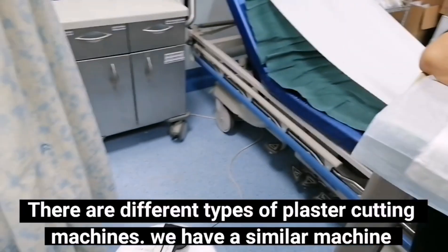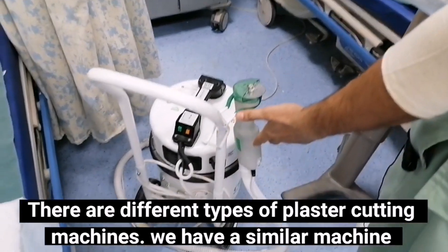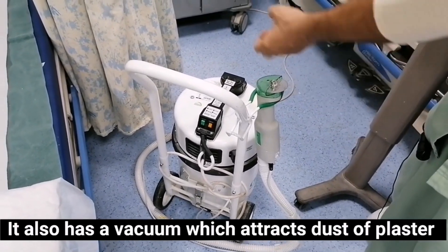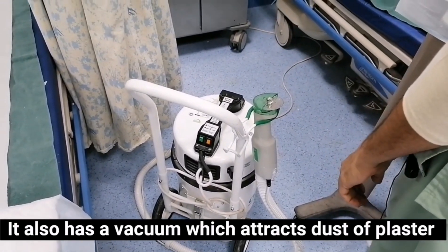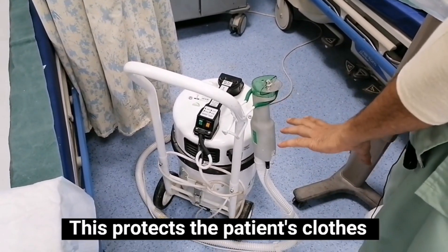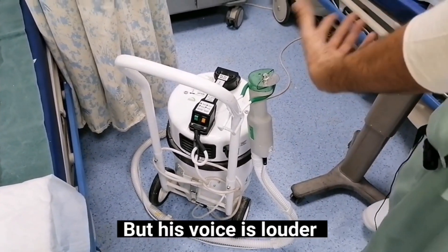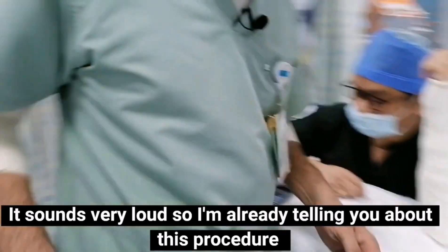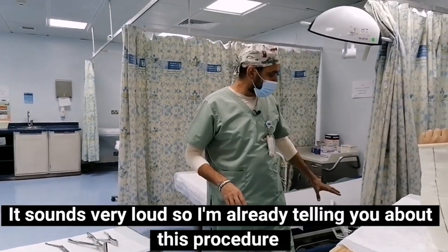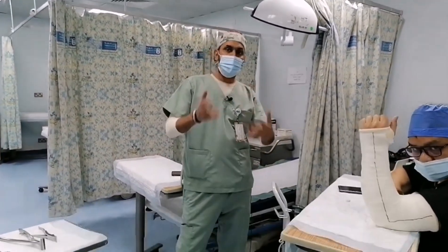There are several types of plaster cutting machines. We have a similar machine. It also has a vacuum which attracts the dust from the plaster — this protects the patient's clothes. Its sound is loud, so I will tell you everything about this procedure now, because you will not be able to hear me when I am using this machine.